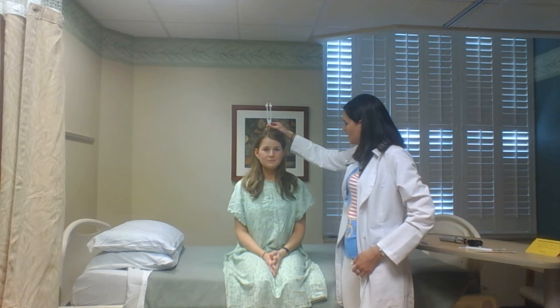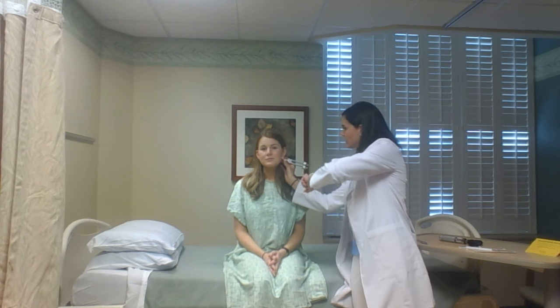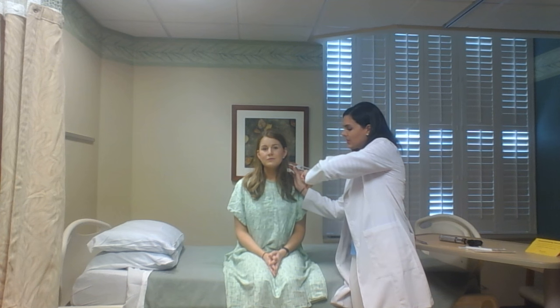Now I'm going to perform the Weber test. You hear that? Yes. And now I'm going to test the Rinne test, and put this on her mastoid process. Okay, all right. And the air conduction is greater than bone.